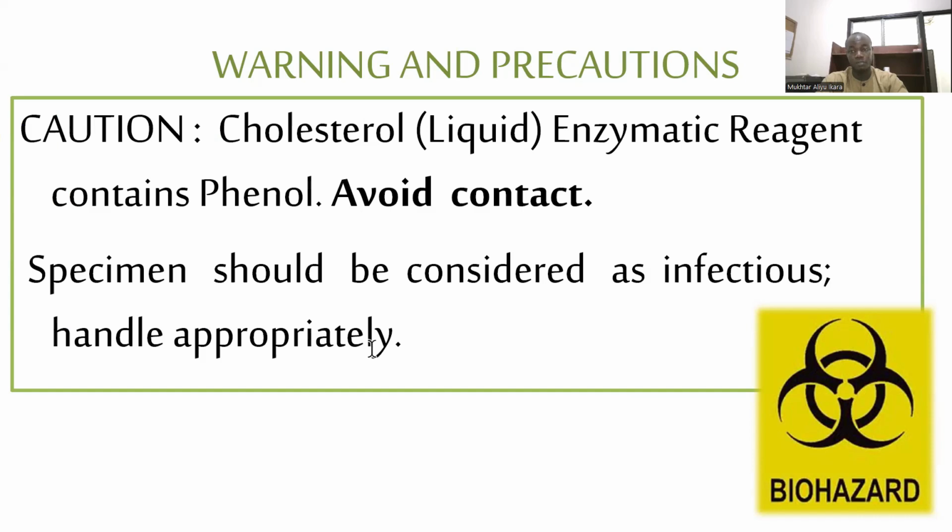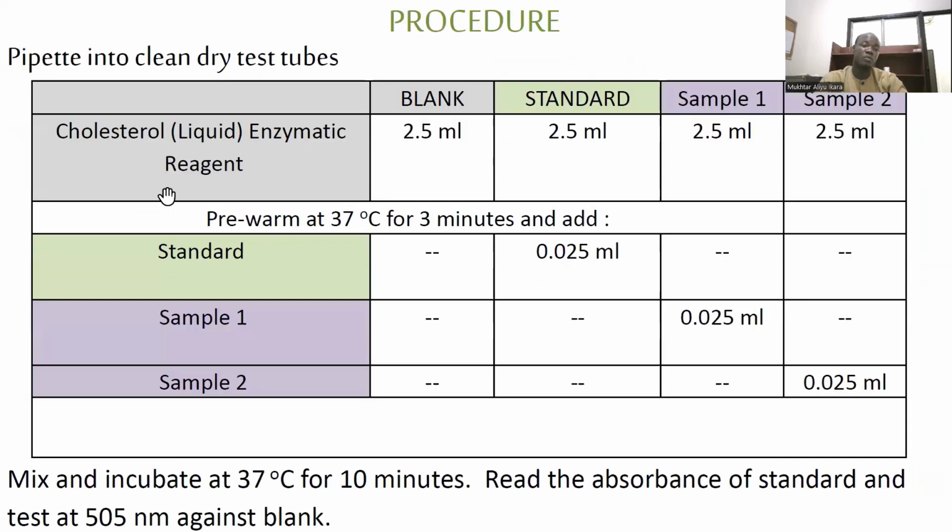Handle it appropriately, because you are sometimes collecting a blood or serum sample from a person. You might not know that he has any infection, so you have to handle it appropriately to avoid contaminating yourself. So this is how to do the procedure.